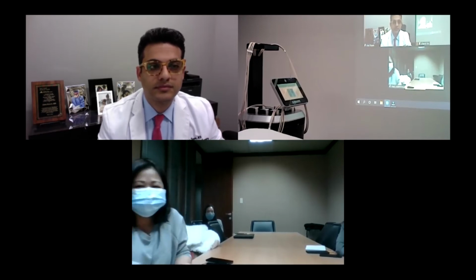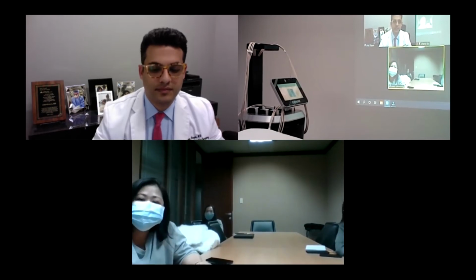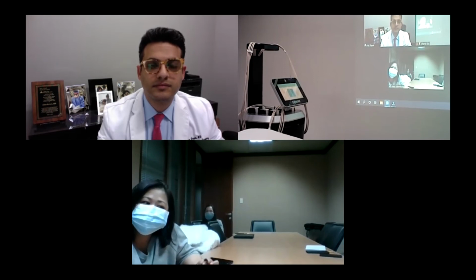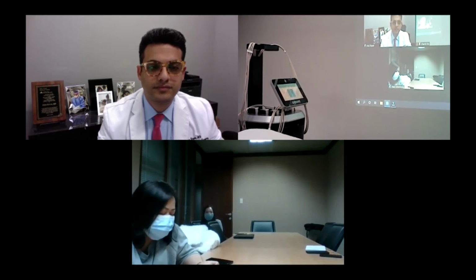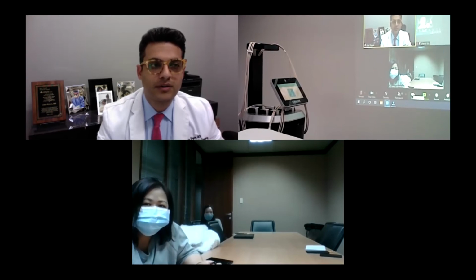I have a question, doctor. I just wanted to ask, with the microstimulation, would it be advisable for us to ask the patient to set it in a higher, stronger setting? Does it follow that a stronger setting of stimulation plus the RF would come out more effective, or it doesn't? Yes, that's a great question. So the device goes up to a power of 50.